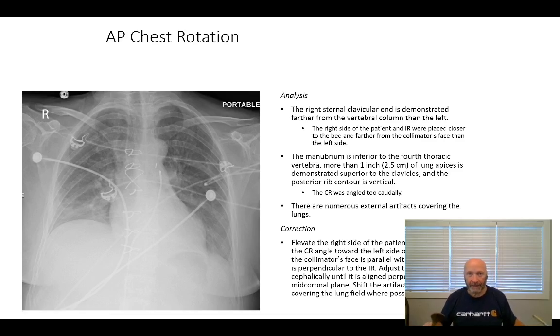So that's AP. This is going to be a little more difficult for PA. I don't have a mirror in front of me. This software doesn't show me an image of myself, so I'm working off a stripe at the top of my computer, about that wide, where I can see my reflection.